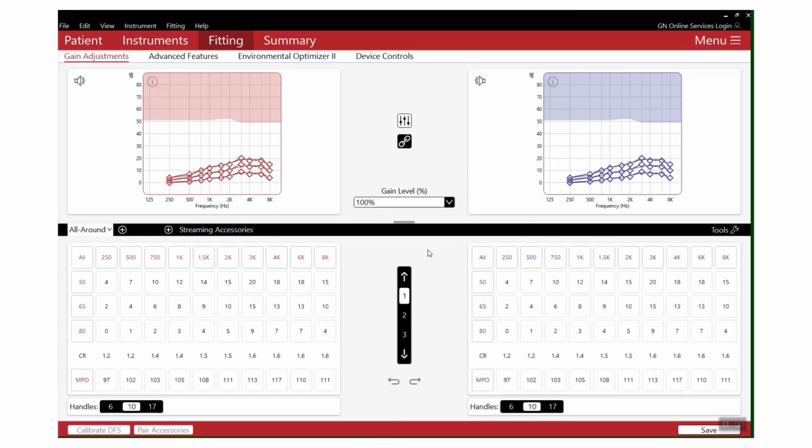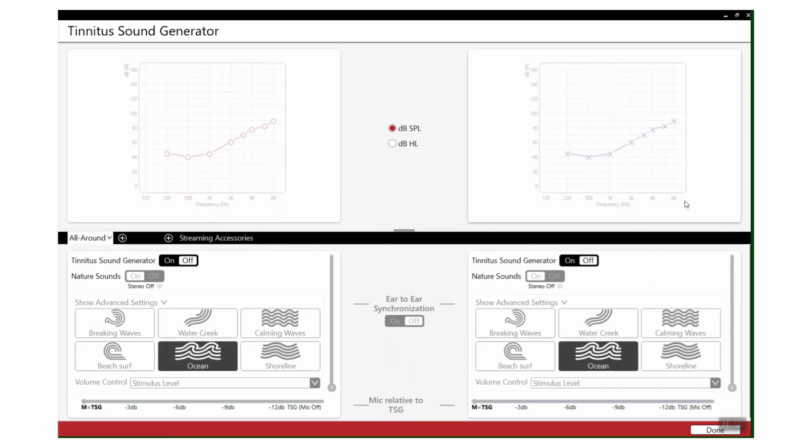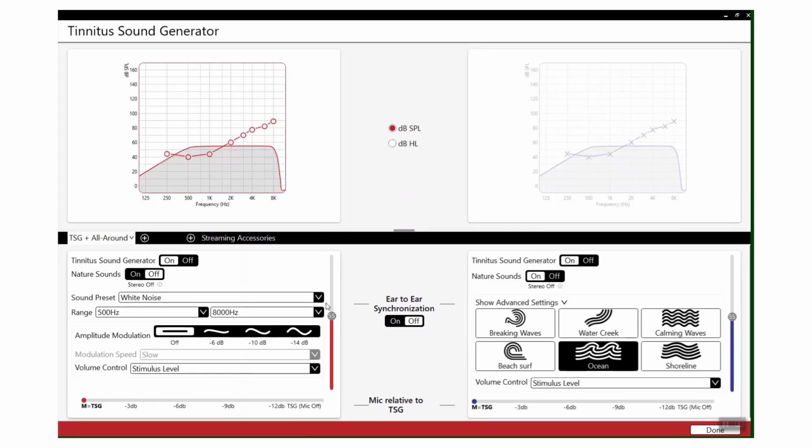Finally, tip 6, tinnitus relief. We currently have 2 helpful tools that can help those suffering with tinnitus. The first thing we have, which is within the software, is our tinnitus sound generator. You'll find it in menu and then down under fitting. So the tinnitus sound generator allows you to apply different masking noises at different levels depending on what your patient needs. You can apply it monaurally or binaurally. You can have nature sounds on or off. There are plenty of different presets that enable you to hopefully help that patient manage their tinnitus.